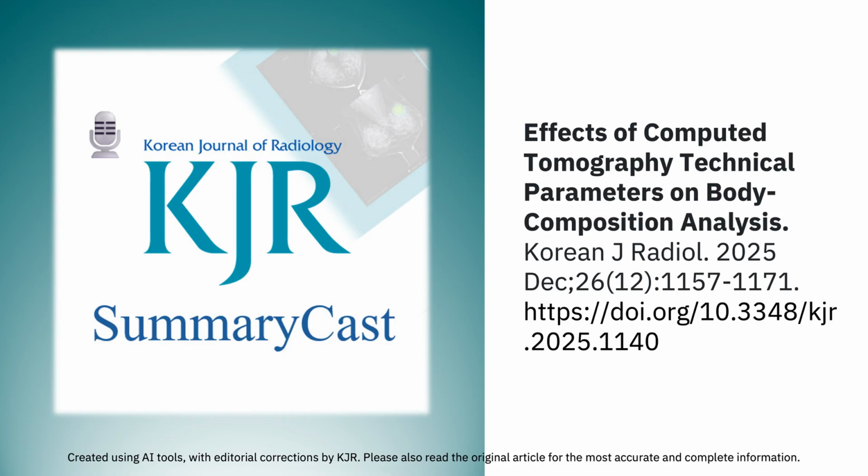The authors make it clear that we're moving from an era of ignoring these technical factors to actively recognizing and trying to correct for them. So the bottom line is, CT-based body composition analysis is a powerful tool, but it's far more sensitive to technical parameters than many of us might have assumed. For anyone using this data, awareness and consistency are paramount. That's the key message. The measurements are not absolute. They are shaped by the physics of how the image was created. Acknowledging that is the first step towards more robust and reproducible science. An important lesson for a rapidly growing field.